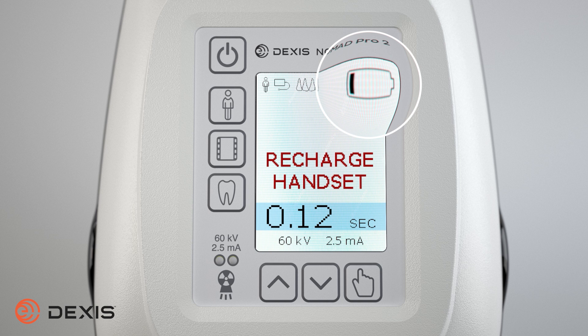When the battery level is depleted to a single bar, we recommend the battery be recharged.